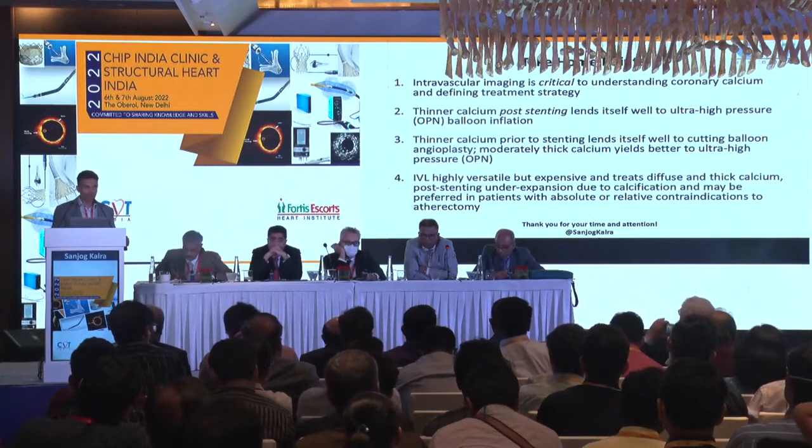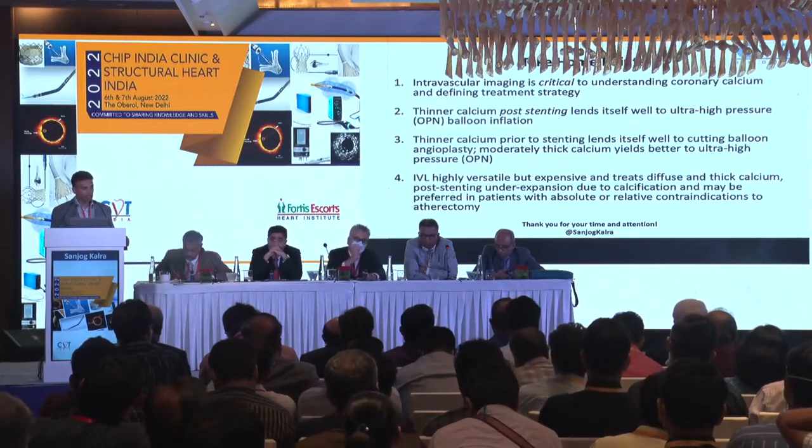And remember that these tools are highly versatile, but you will be most impressed when you walk in there, you take your targeted tool, you get the result you want, and your case is done in 30 minutes instead of an hour and 30 minutes, because you went through one balloon instead of 6. Thanks very much.